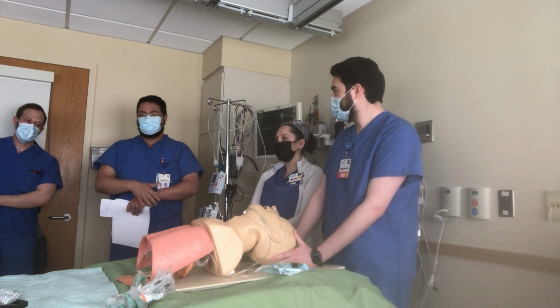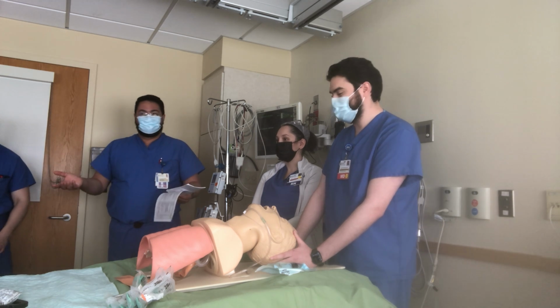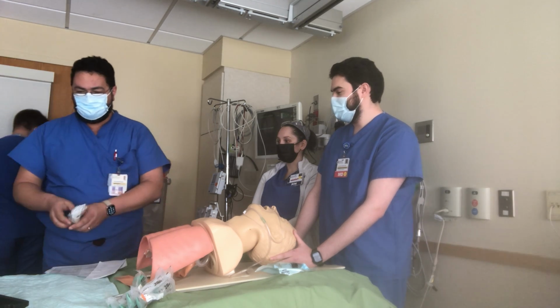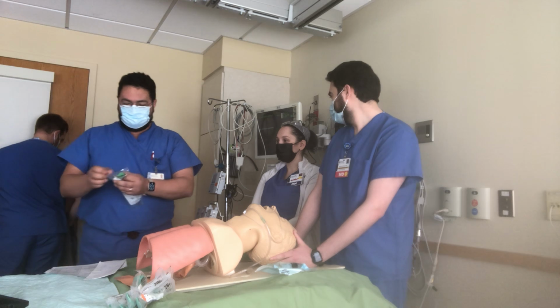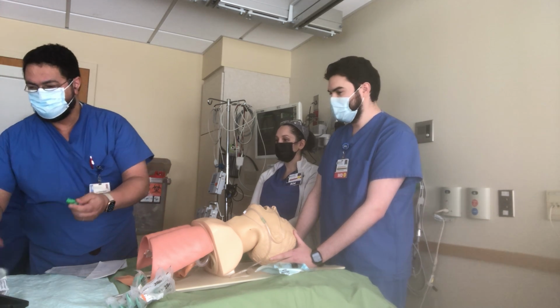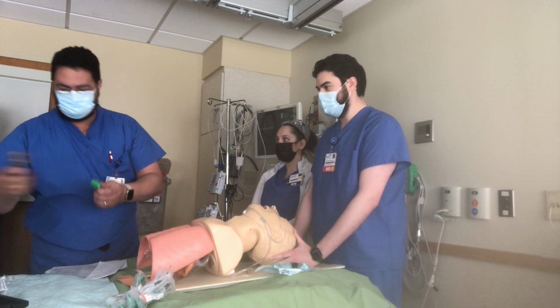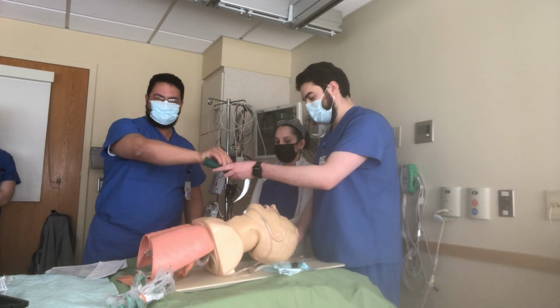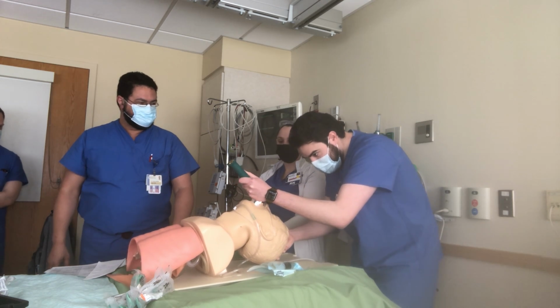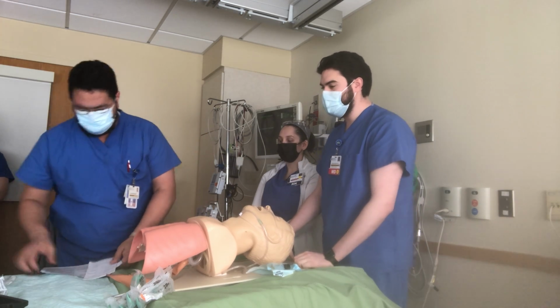Think realistically. What would we do in this ICU? The glide scope is the way to go. Don't start with the Mac and Miller blade, because they're not designed for difficult airway. Try to see if you see anything. All right, so assume that you couldn't see it, then it becomes the glide scope now.